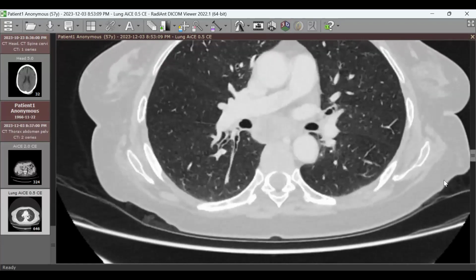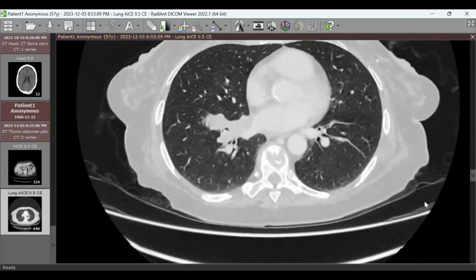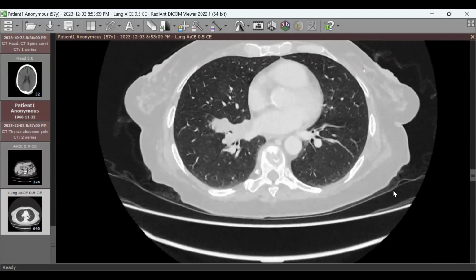Now, this is the primary lesion. Yes. And so you think now, most likely, this is a carcinoma. Yes. And in your report, you want to provide the necessary information for the clinician to have the staging of the lesion, right? Yes. What information do you need from the scan to achieve this purpose?